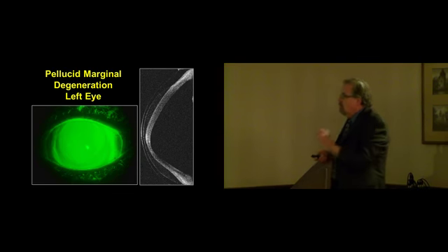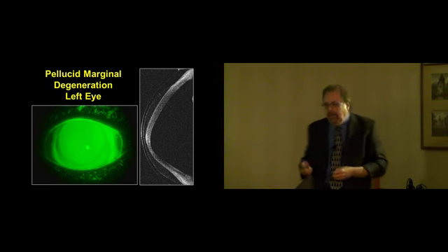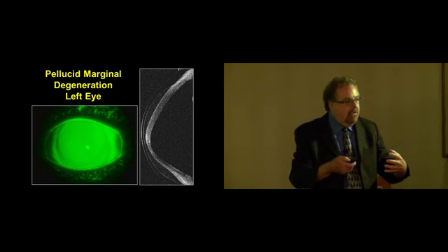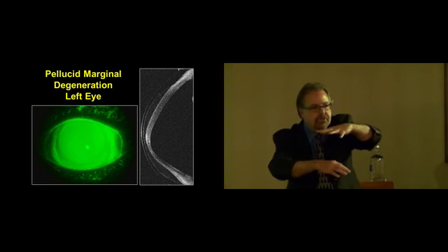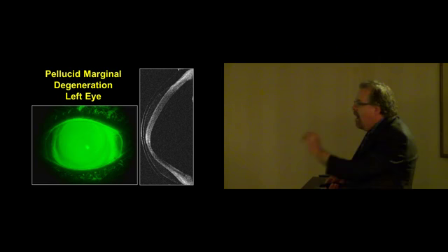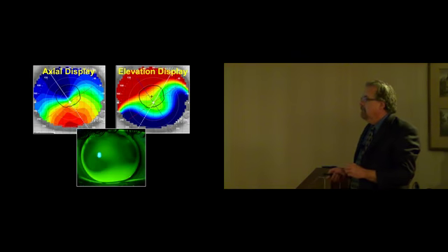You see, what the scleral lens does is it allows us the ability to completely vault over all of these asymmetries in the cornea. Where we have all these different height differentials, it allows us to just completely vault over that area. And this is why these lenses are so exciting for these irregular corneas.